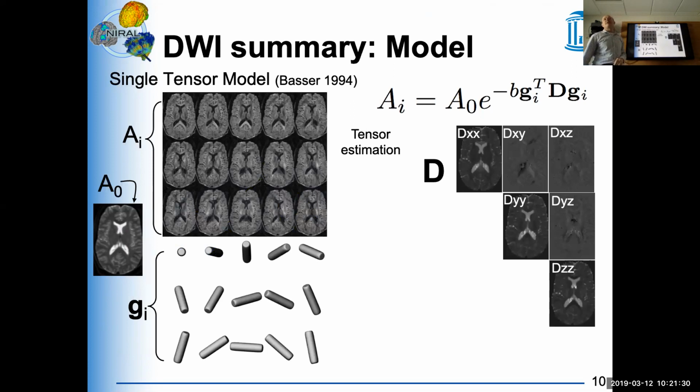If you're using FSL to reconstruct the image, it will actually write these images out like this, rather than as a tensor image. You can tell it to do a more modern representation, which would put all of this into one image, which is what we usually do when we process the data. But the old style would be that you would get a DXX, DYX, and so on. This is basically just a local representation, on the per voxel level, of what the tensor is. So this is the tensor that we computed.